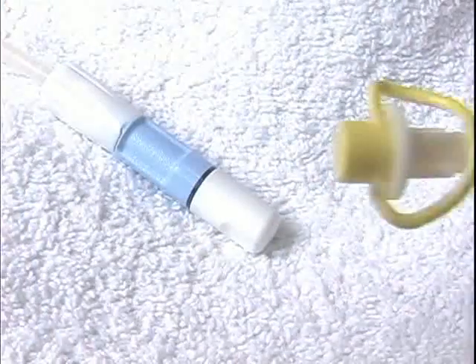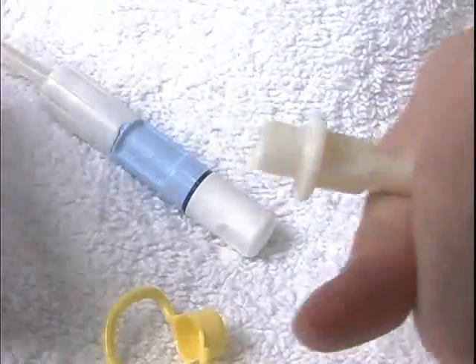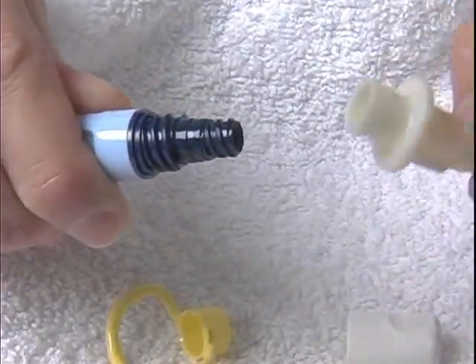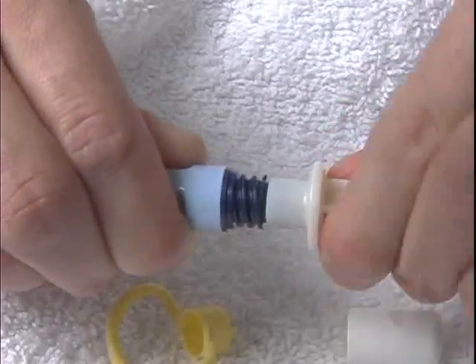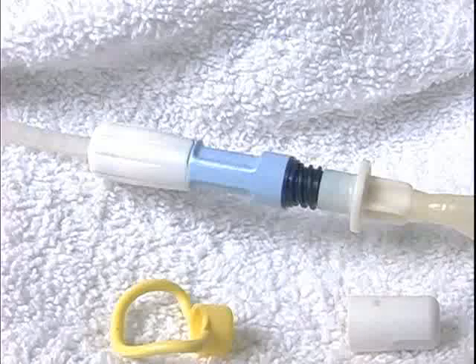It is important to use enough gel to cover both sides of your hand and rub until they are dry. Remove the pull ring from the twin bag connector with one hand. Drop the ring onto your lap. Keeping hold of the twin bag connector, pick up the transfer set and remove the mini cap. Drop the mini cap on your lap and connect the two at once. Wipe away any excess iodine with gauze. Avoid touching the twin bag connector and the transfer set to prevent infection.